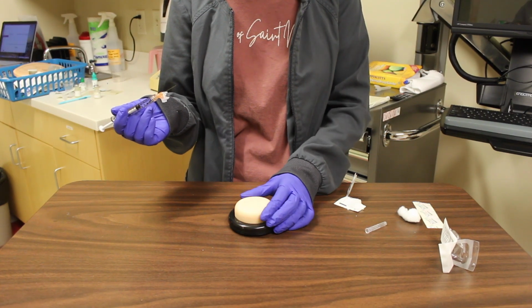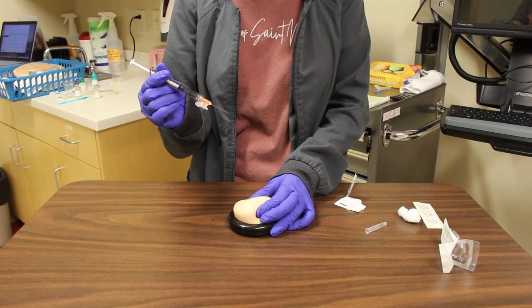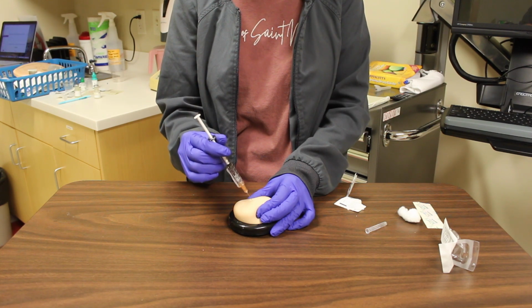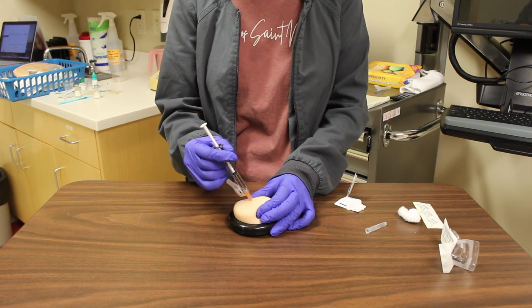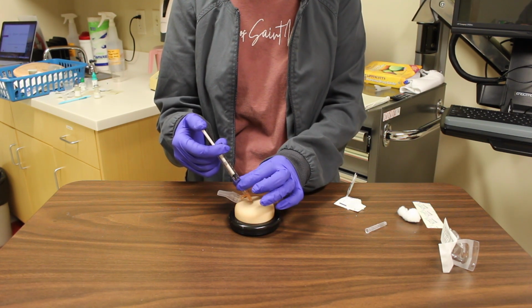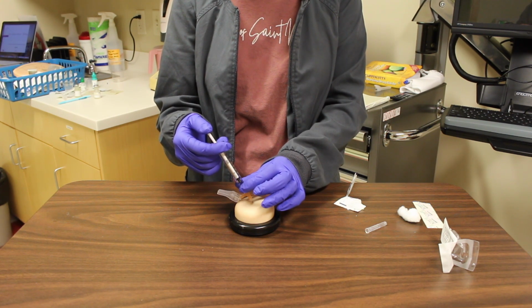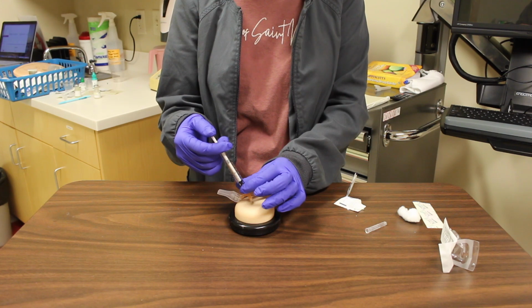Hold the syringe between the thumb and the index finger of the dominant hand like a pencil or a dart. Insert the needle at the appropriate angle into the pinched up skin or the taut skin if working with an obese patient. Stabilize the syringe with the fingers of the non-dominant hand. Using the thumb or index finger of the dominant hand, press the plunger slowly to inject the medication.